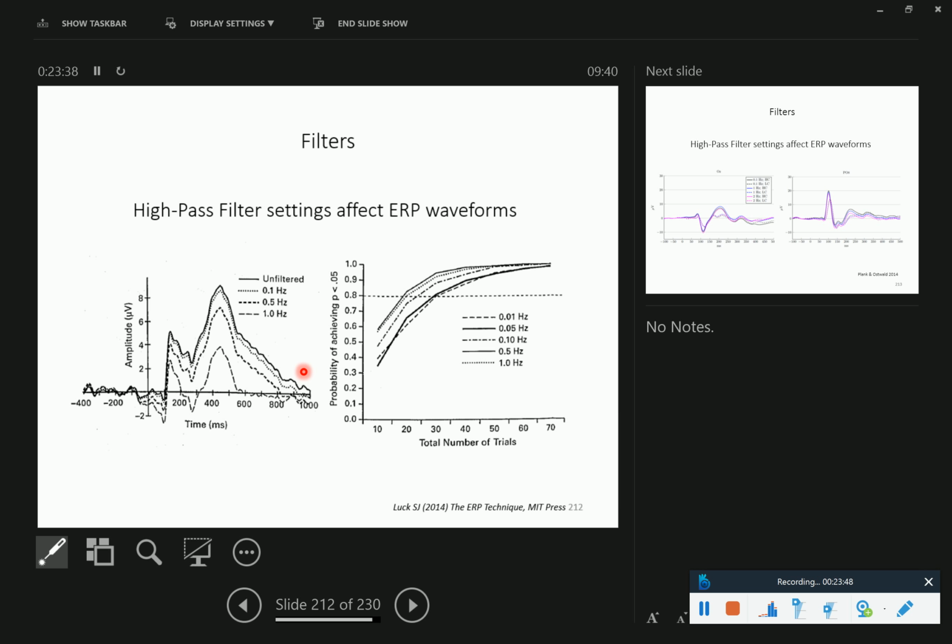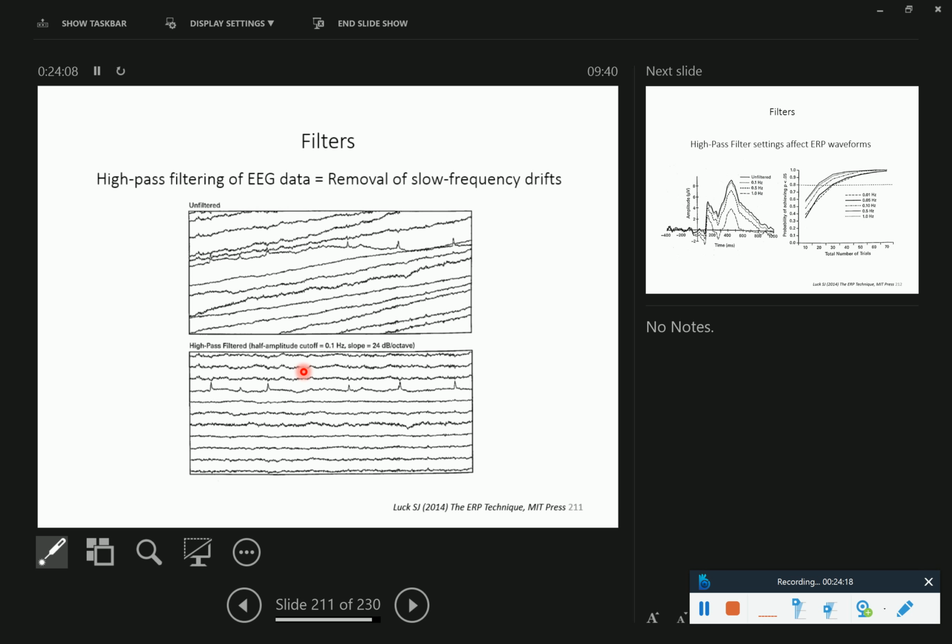And the important thing is that you don't think that filters are specific to EEG. The same thing happens in fMRI, it happens everywhere. The specific implementation of filters varies. You can have filters that transfer to the Fourier domain and act there, or you can have filters that are implemented as kind of averages. There's quite a lot more to learn about filter implementation, which I don't have in here because it's also not that interesting.